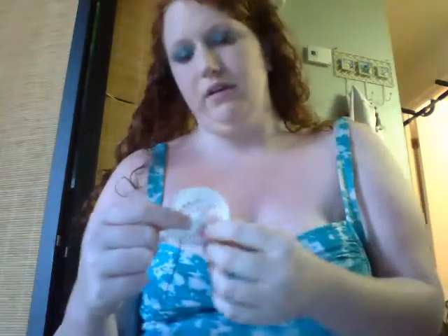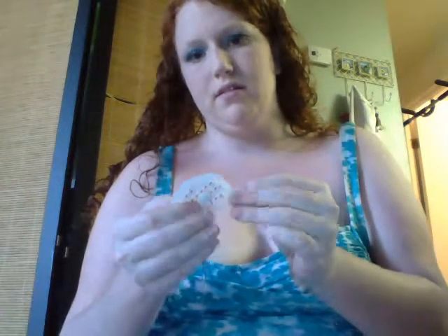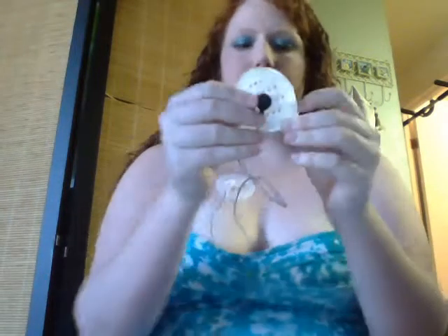And this is how it looks. You don't want to put it on your heart, you just want to put it in this area. And they said they keep changing it out, so yeah. So then just stick it in a good place. Okay, and then the other one. You can go under your shirt, or you can go over. I go over because it's the simplest.